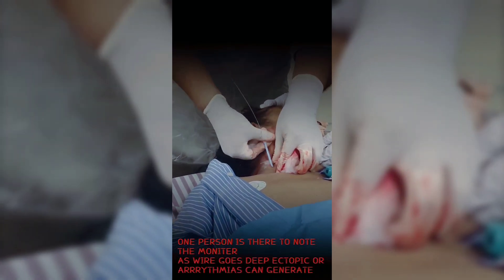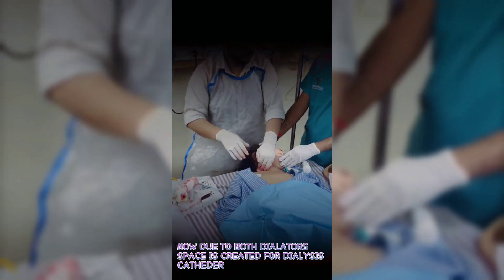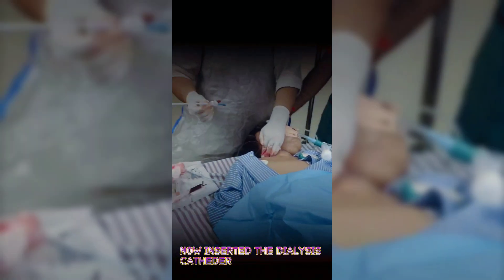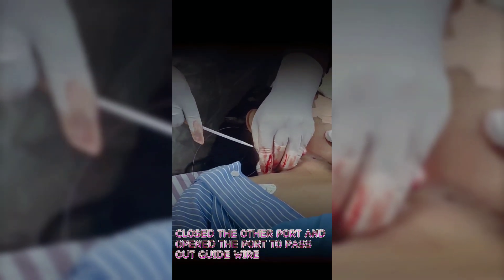As the wire goes deep, ectopic beats or arrhythmias can be generated — watch the monitor carefully. With both dilators, adequate space is now created for the dialysis catheter. Insert the dialysis catheter, close the other port, and open the appropriate port to pass out the guidewire.